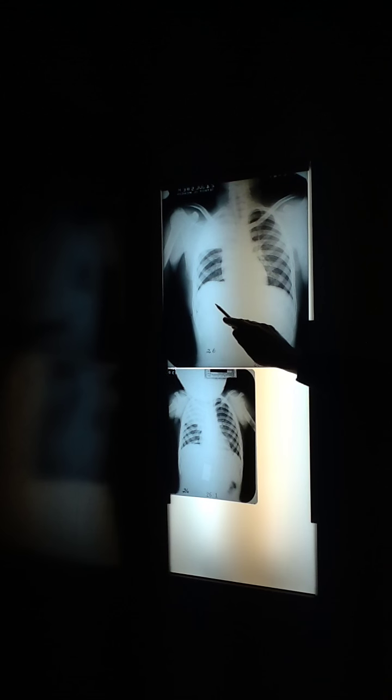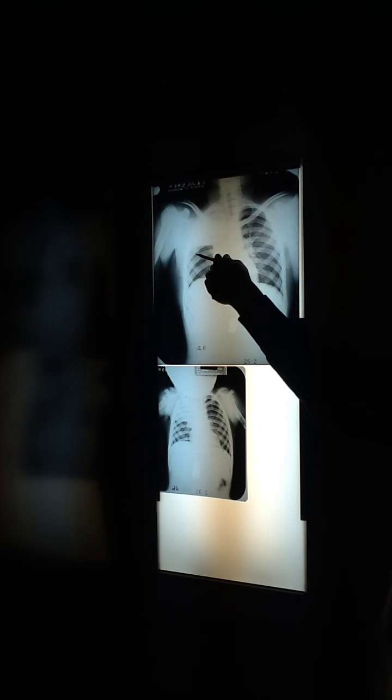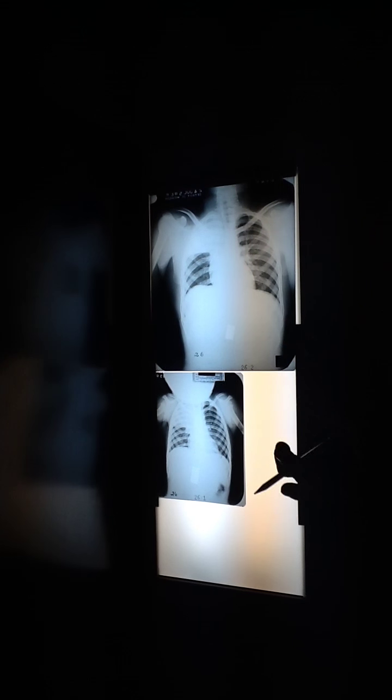Would you say the density is homogeneous? Yeah. Now, does everybody understand what that means? What does homo mean? Same. Hetero? Different. Multiple, different. So this is homogeneous water, isn't it? Liver. It's just water. It's water density. Heart's water. Now it's muscle and liquid, but the beam sees that all the same, doesn't it? The beam sees liquid and muscle as the same density.